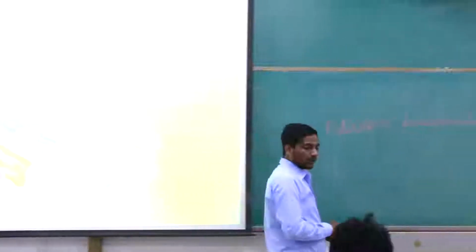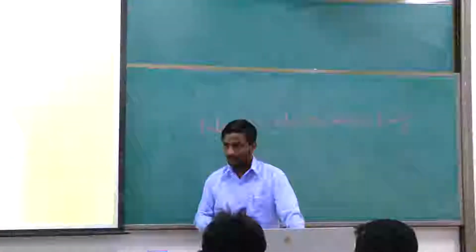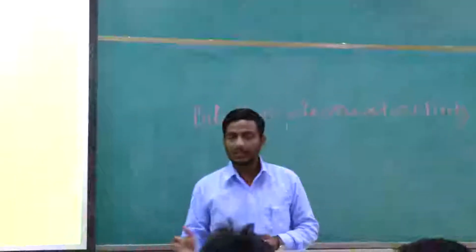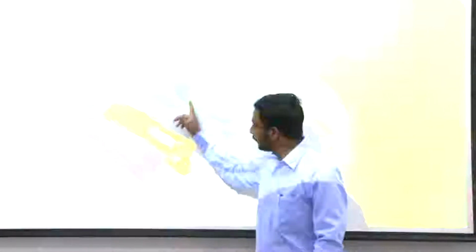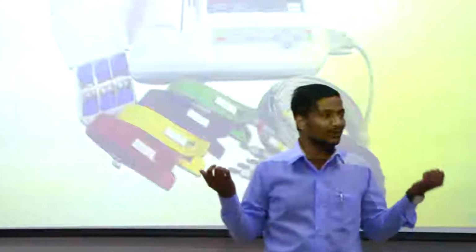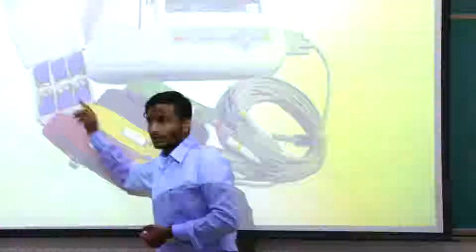Now keep in mind, whatever we are going to learn today is only for the 12 lead standard ECG. Right? We are not going to see the vague forms of the ECG, but the standard ECG. And the standard ECG has how many leads? 12 leads. So when we look at this machine, we can see that it has 4 electrodes which we place on the limbs. And since we have only 4 limbs, we have only 4 limb electrodes. And we have 6 chest electrodes, you can see these are the electrodes, which we place over the chest. Sometimes these chest electrodes we also call pericardial or precordial electrodes.